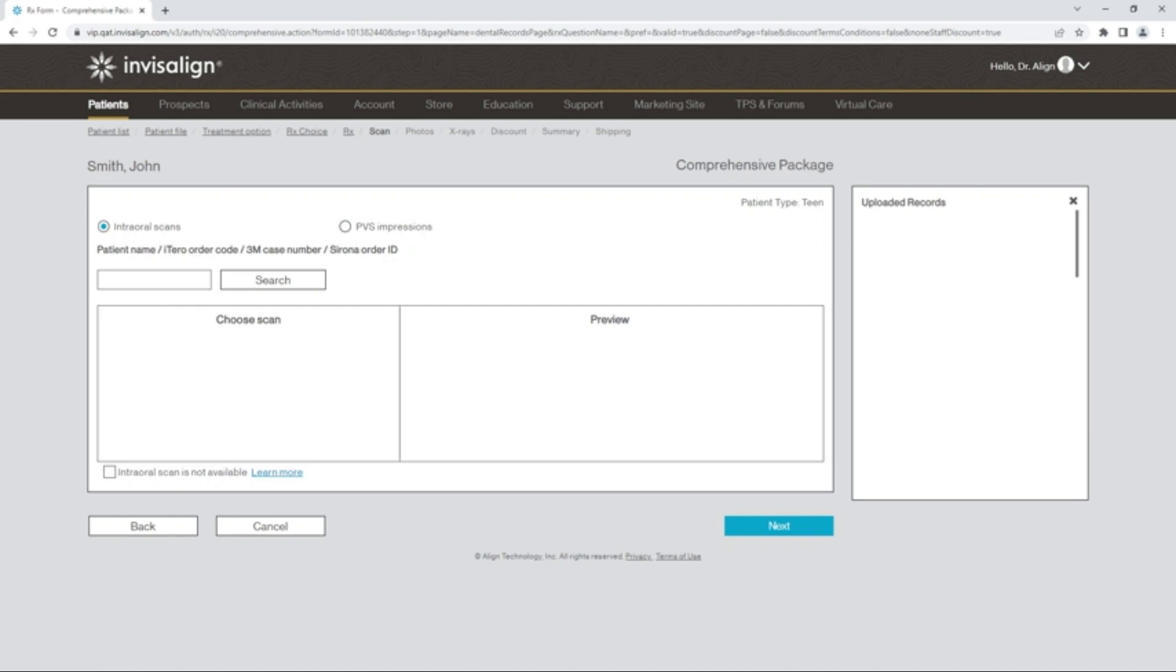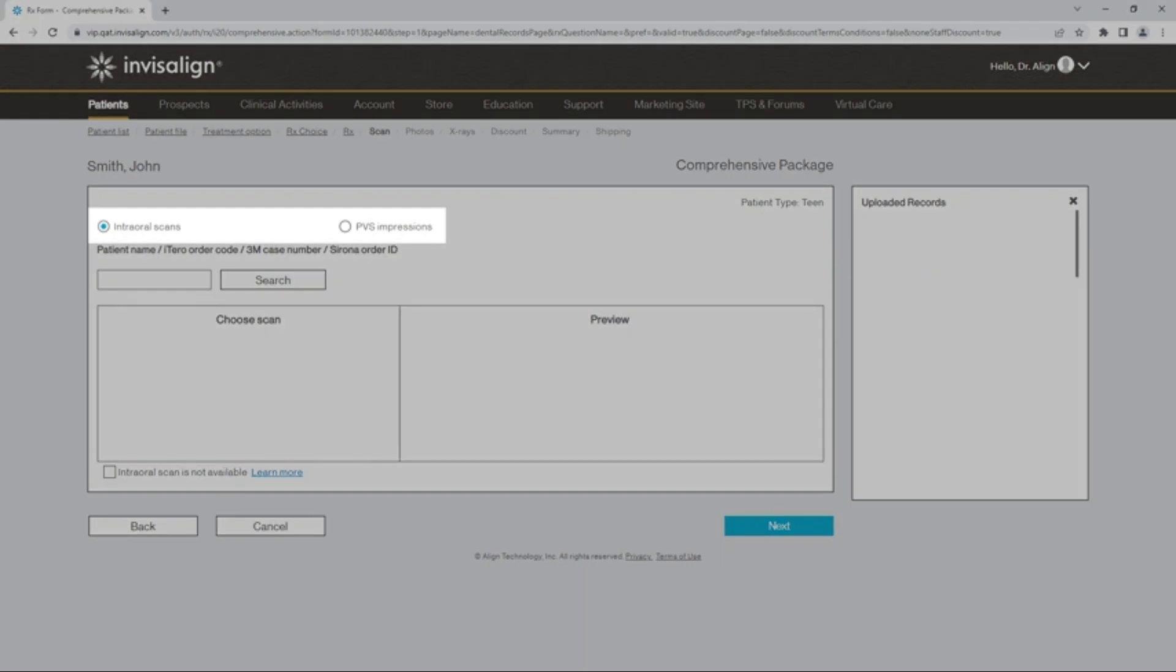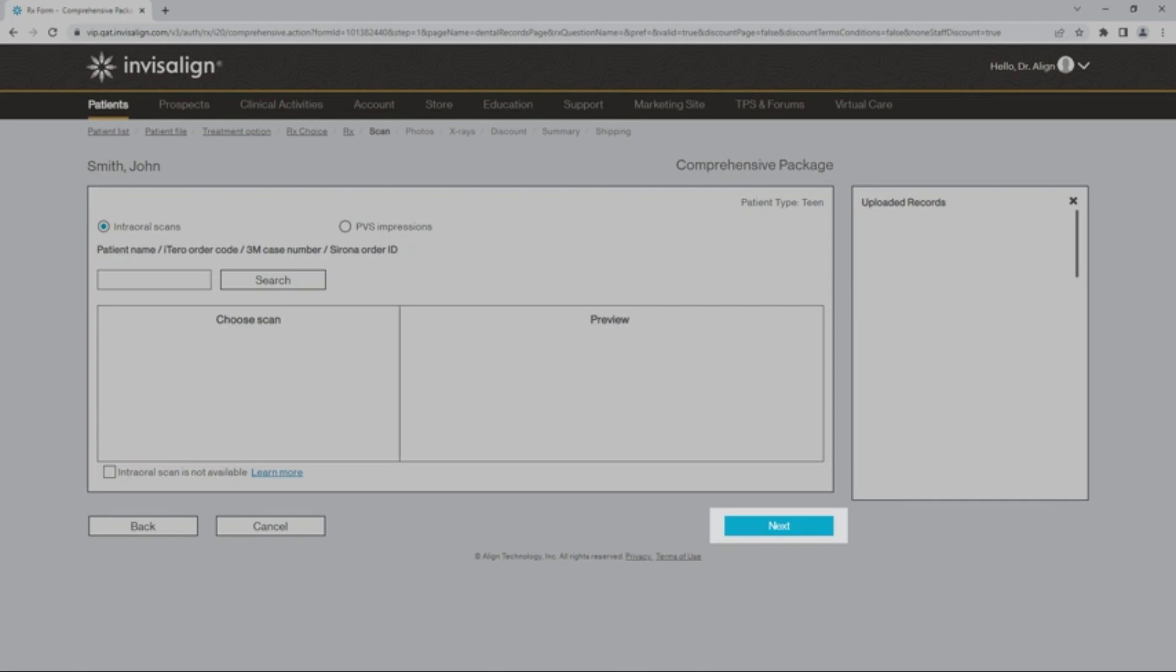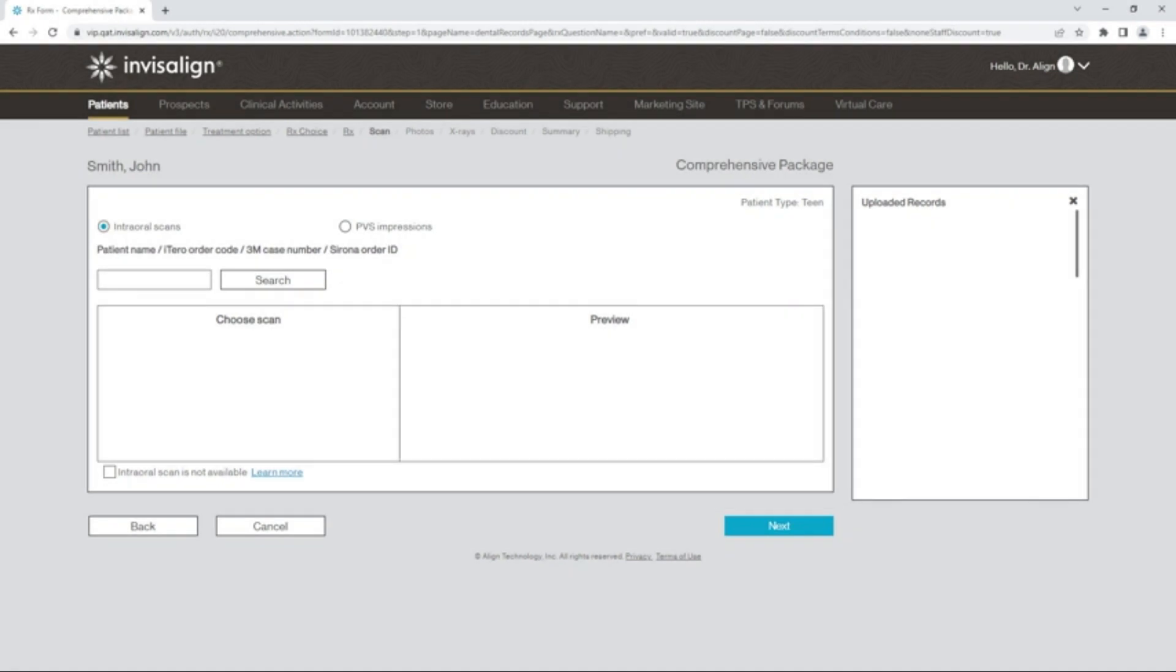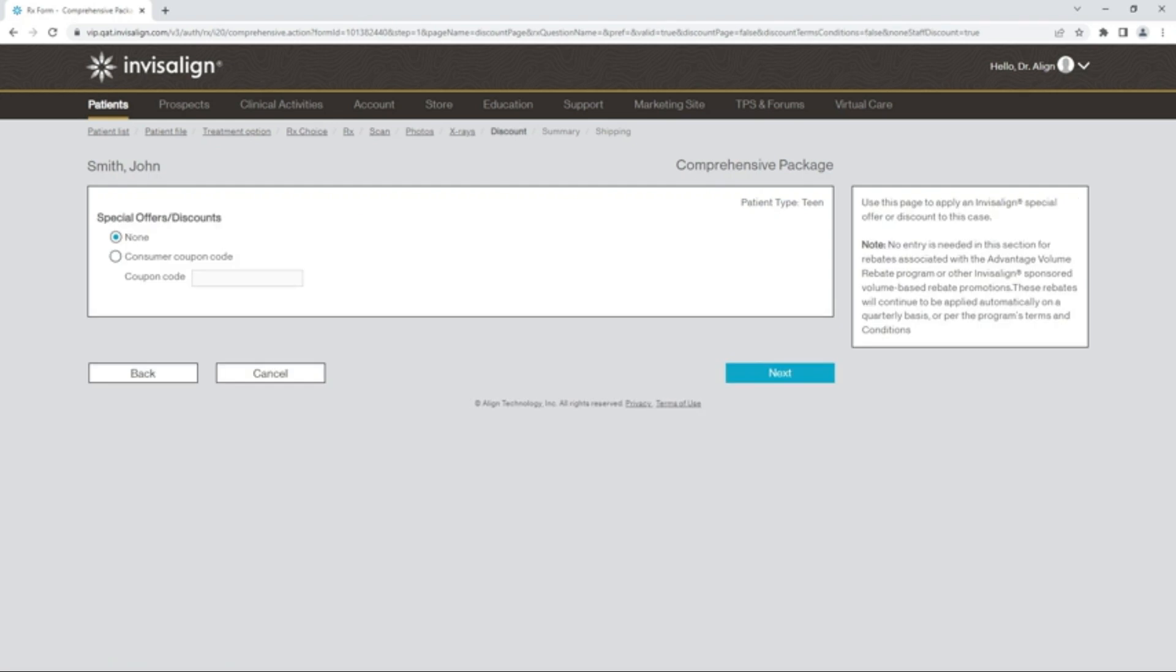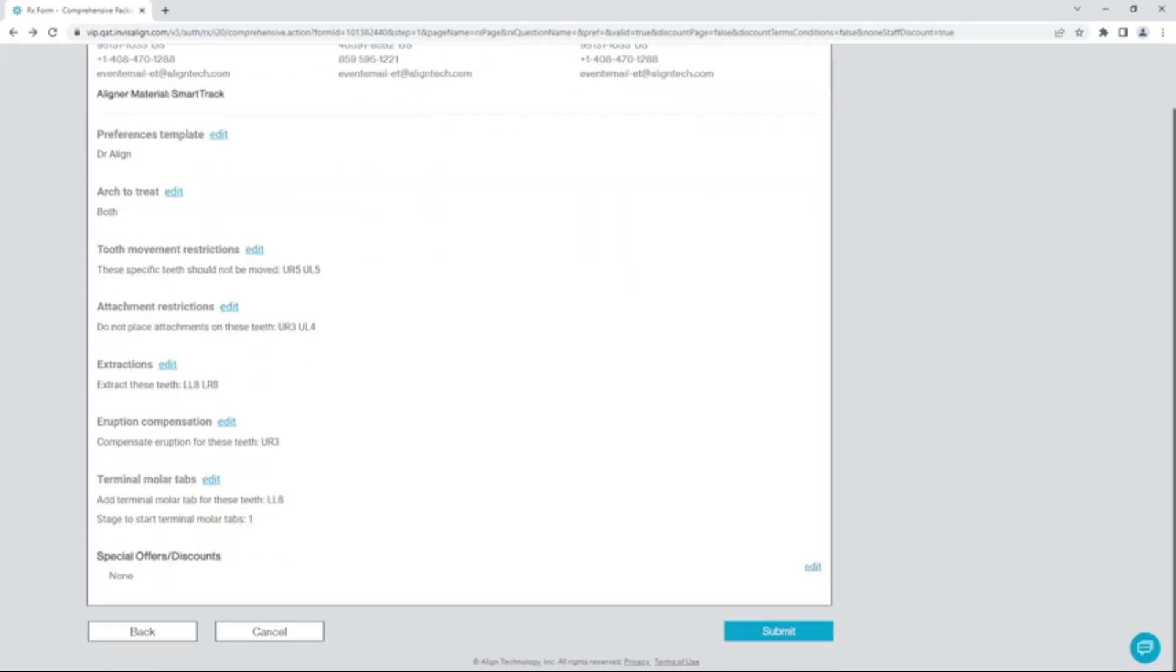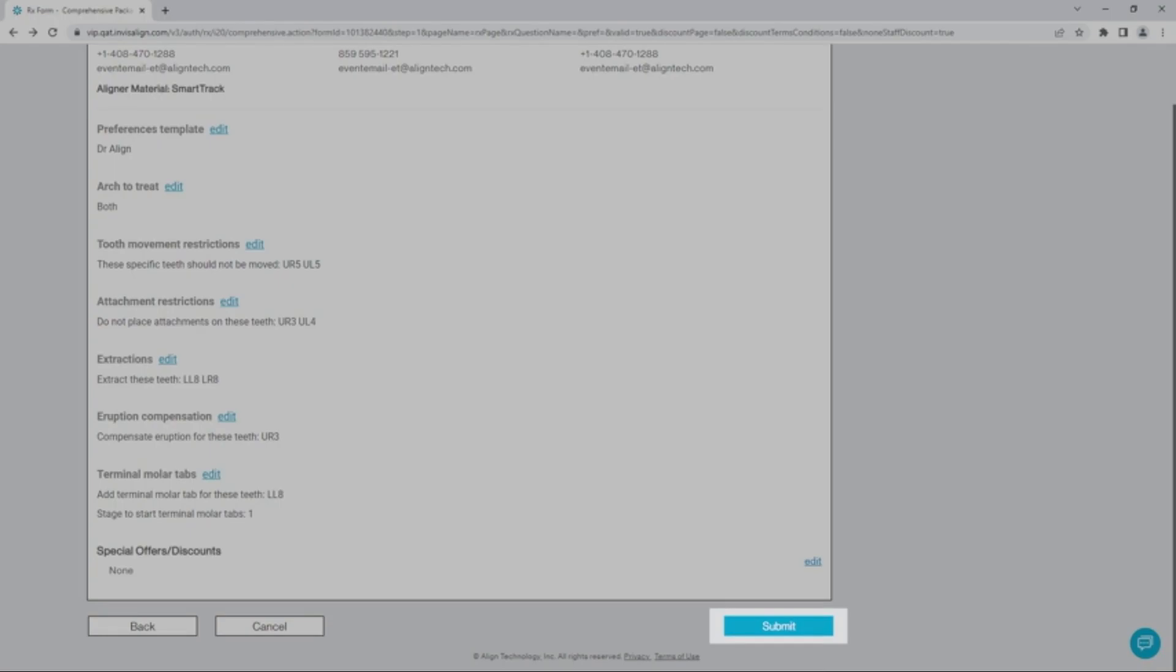To complete the prescription form, select Intraoral Scans or PVS Impressions for the patient, and select Next to check the Summary page and submit the case for ClinCheck setup. Upload any scans, photos, and x-rays, if not already uploaded. Select No for study participation, if applicable, and enter Discounts, if any. Check the Summary page, and then Submit.